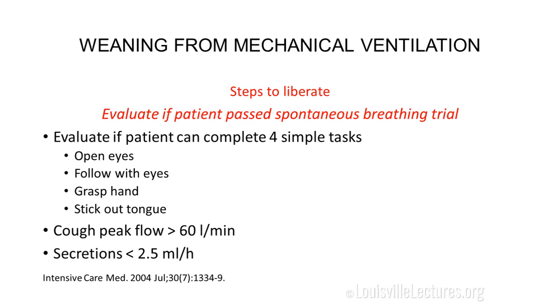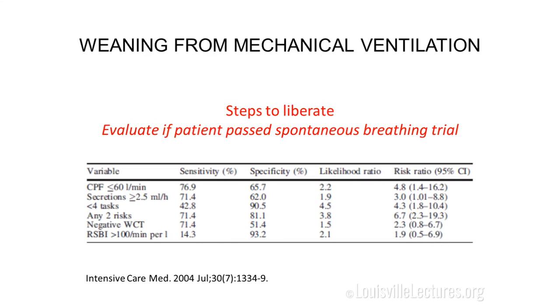So you can do that bedside. And again, in some studies, they have actually measured the amount of secretions. We haven't been doing that, but you want to talk to your respiratory therapist and your nurse and make sure the patient doesn't have a lot of secretions. And this is just showing the predictive value of these variables.